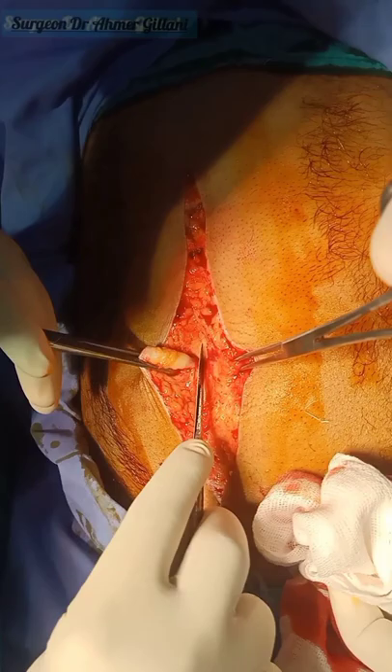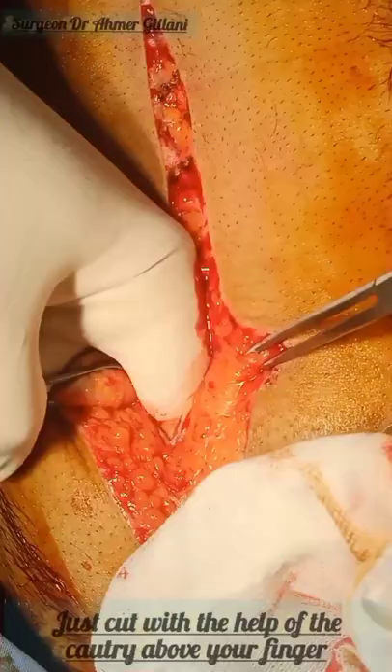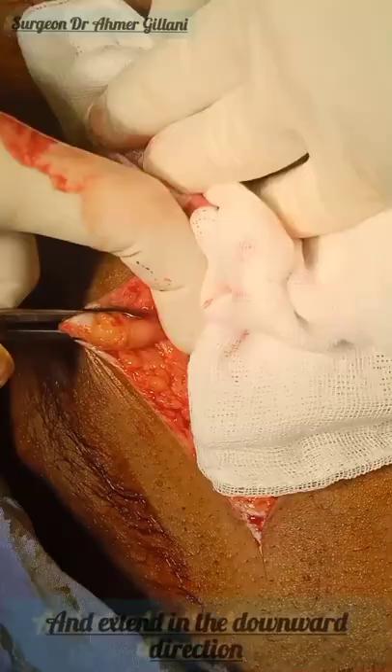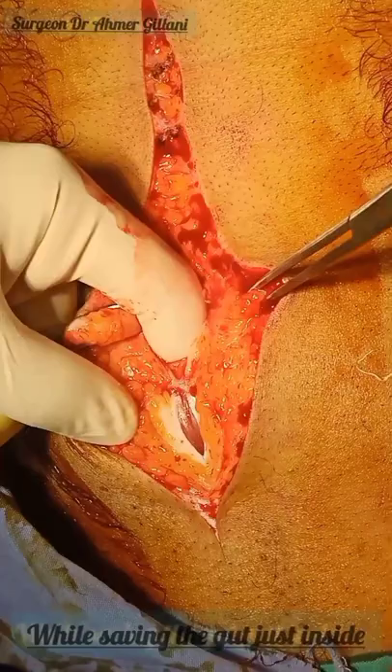Securing the underlying gut, we are cutting in the midline with the help of the sharp blade. After that, the abdomen is almost opened. You will put a finger in that hole, and on your finger, with the help of the cautery, you will proceed the incision in the downward direction. You will put the finger to save the gut which is just behind our cutting area, so we are proceeding in the downward direction.